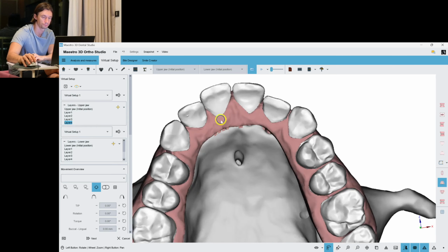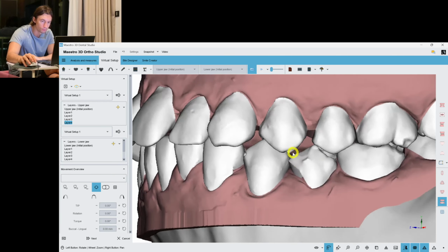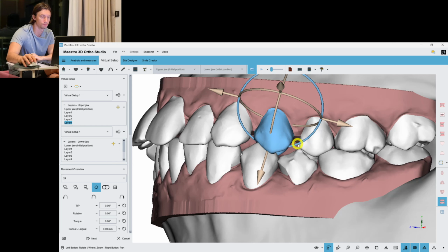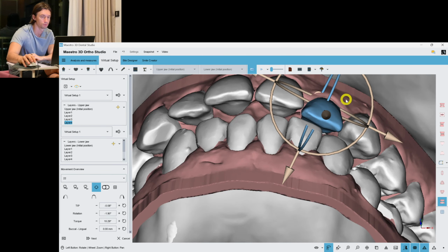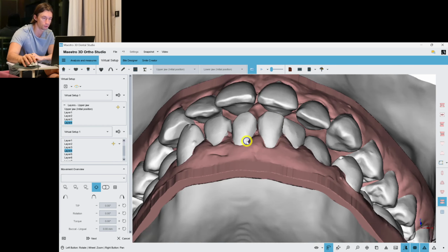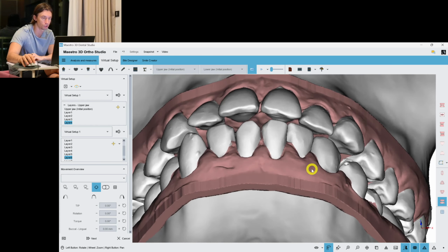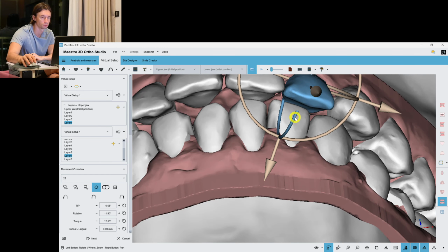Layer 4. Moving the premolar. And checking the contacts between them. I think they are good. So we start to move the first premolar, distal tipping and some expansion. Here we see a sagittal gap, which is good for us because we're going to recline the lower incisors at some stage, so we'll need to have some sagittal gap to let this work. Something like this.